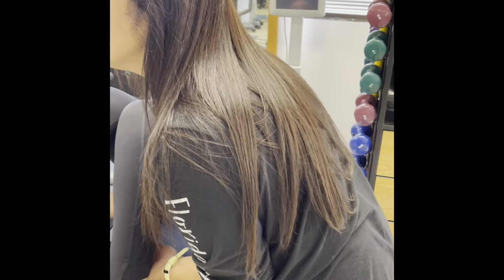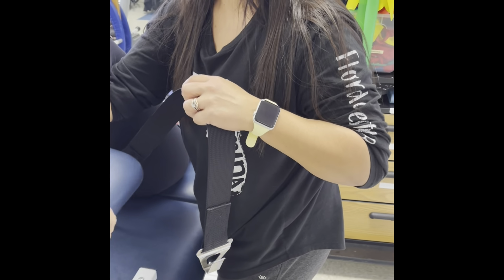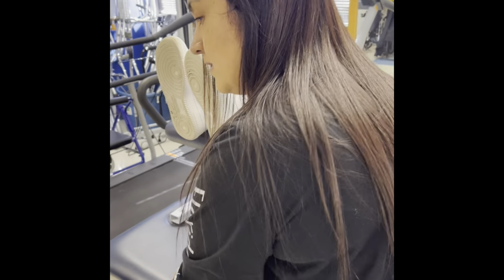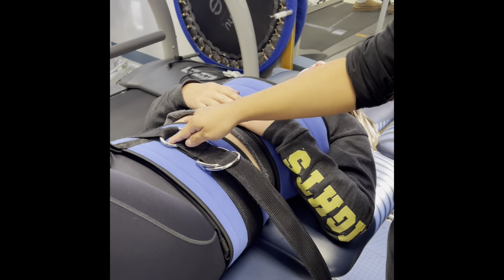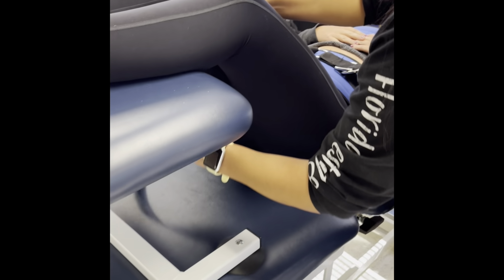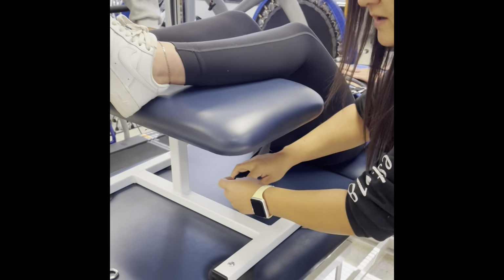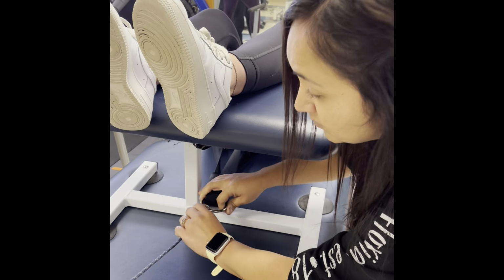Where's our bench? Wendy, could you help me with the bench, please? We want to keep our patient's legs together because again it's a back pain. We're going to put rope release so we can clip this on here. As we continue, make sure that the ring is right at their belly button area, and we're going to get the strap right here and hook it onto that ring. We'll have our rope released so that we can attach it to this bottom ring.